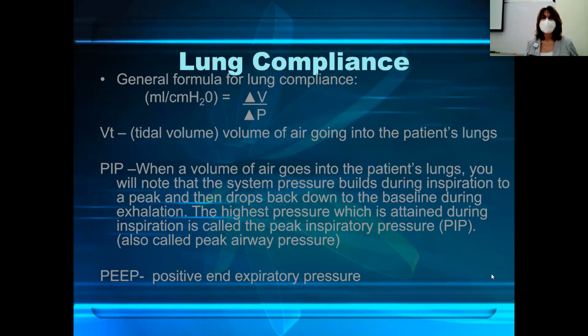It gets very confusing if you're talking to another respiratory therapist. You're talking about the peak airway pressure and you're saying PEEP. It's going to confuse the heck out of them. They think that you're saying something different, PEEP. So you can never say PIP as a word. You always have to say the 3 letters, or you can say peak airway pressure. PIP, peak inspiratory pressure, peak airway pressure. Got it?